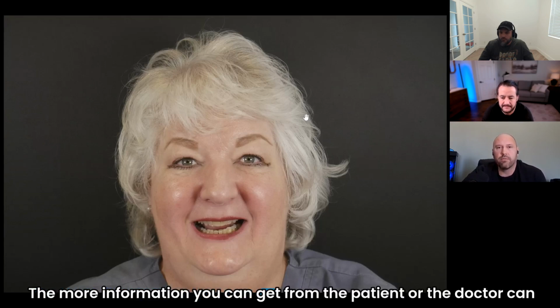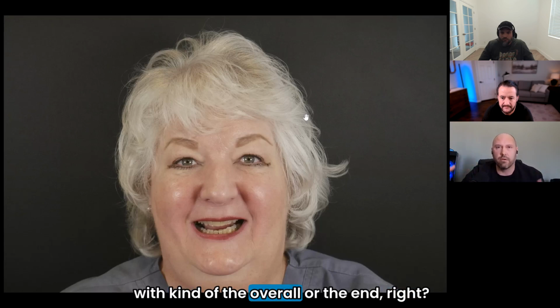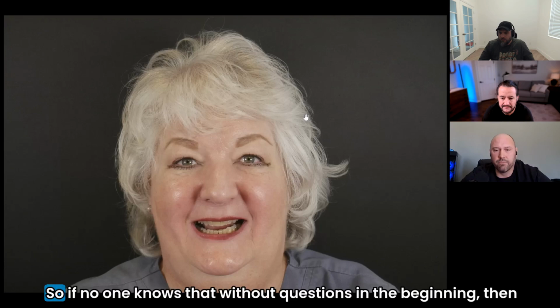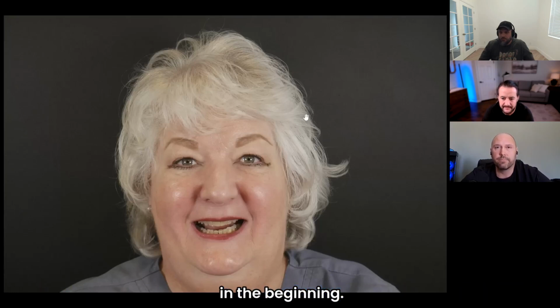The more information you can get from the patient, or the doctor can get from the patient, the better, right? I mean, it's hard to build a foundation without knowing the overall outcome, the end. So if no one knows that without questions in the beginning, then we're all just shooting in the dark, which I believe increases remakes, and things like that could be solved in the beginning.